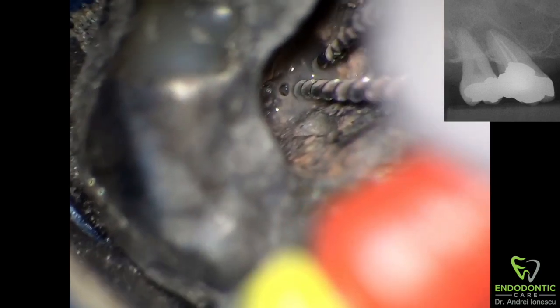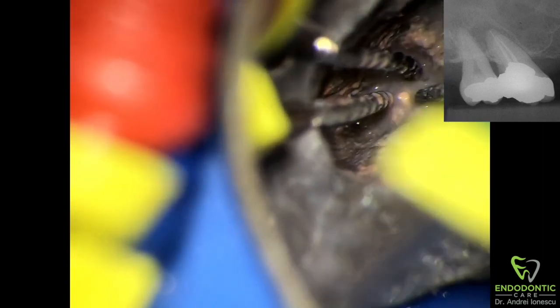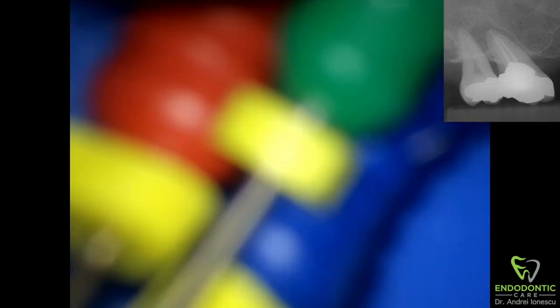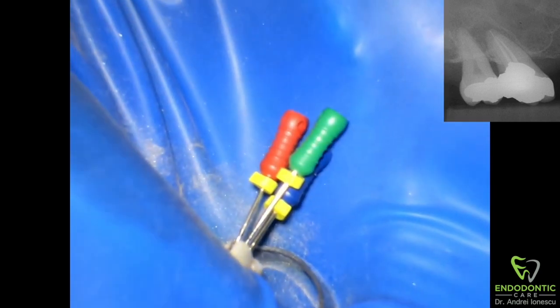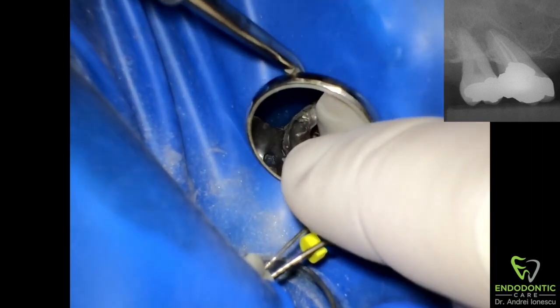After we feel like we've created enough space around the carrier, comes the fun part. Just pick three Hedstrom files — they don't have to be different sizes, but in this case I picked a 25, 30, and 35 — and try to seat them as apical as possible on opposite sides of the thermofill carrier. Put them in, get them on opposite sides, apply apical pressure to engage them a little bit. Once they're in, twist them together, then grab them with a hemostat and pull them out.